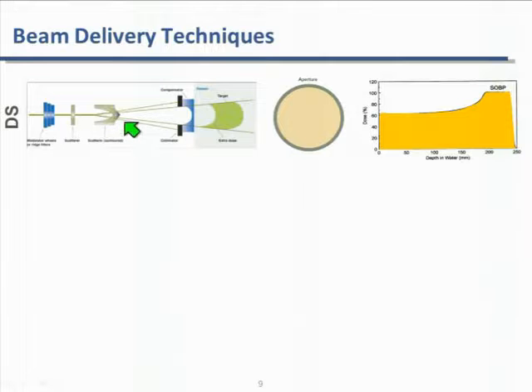By the end of scattering the second time, the beam is wide enough that you need to collimate it and put in a compensator. If you look along the beam direction, you can see, for example, a circular aperture. At any time the entire aperture has protons passing through it because it's collimated, and at depth they deliver dose in this fashion.